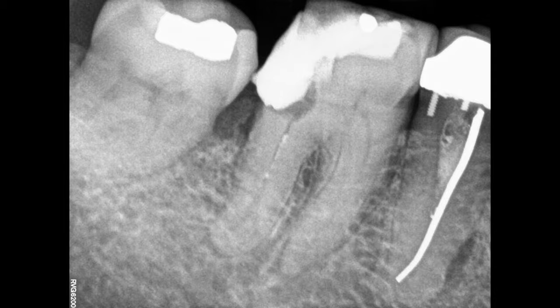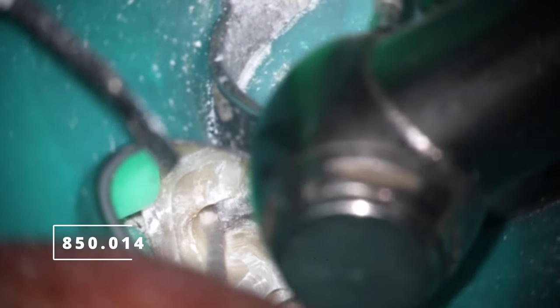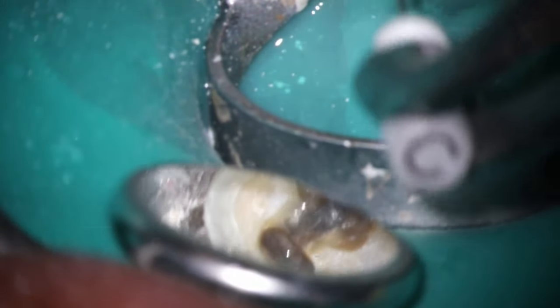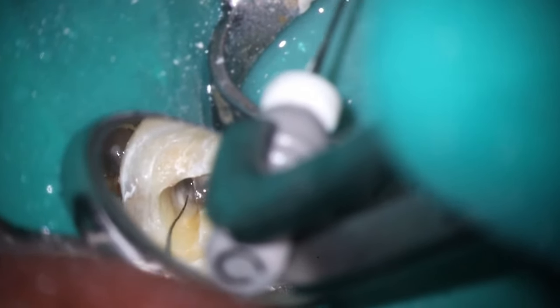That arrow is kind of where I'm looking towards — if I were to extend it all the way over to the mesial, I would be making a huge hole inside this tooth. So sometimes it's better to drill two holes, and that's what we're doing here. I'm going to be using that skinny diamond we like. You can look at the bite wing or PA x-ray to draw that line like that arrow I just showed, and figure out where best to access. In this case, his mesial canals were right below the extent of where that IRM was, so I have a landmark.